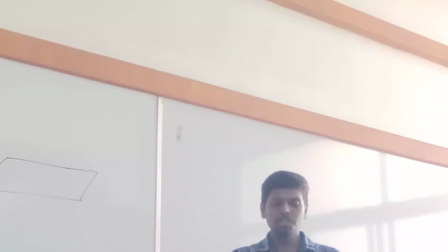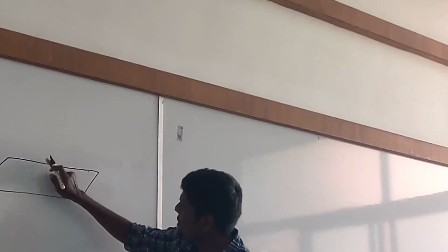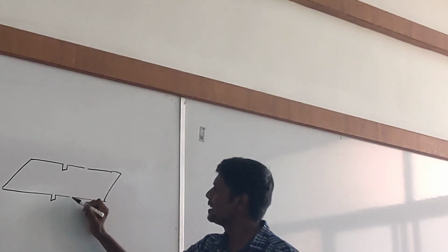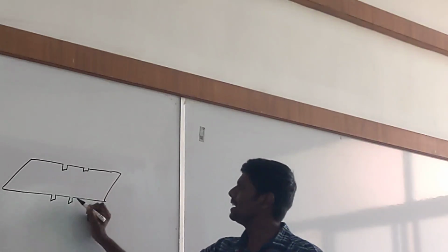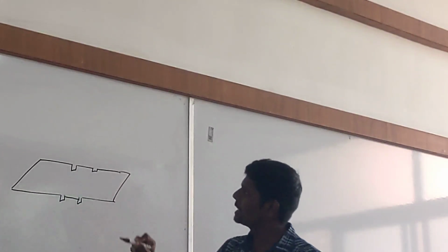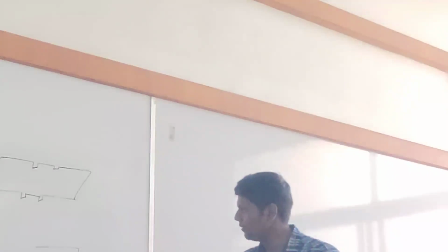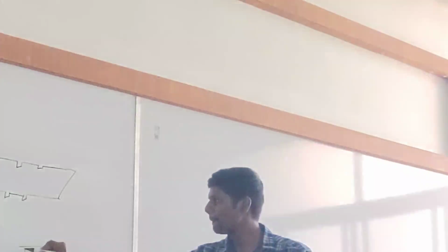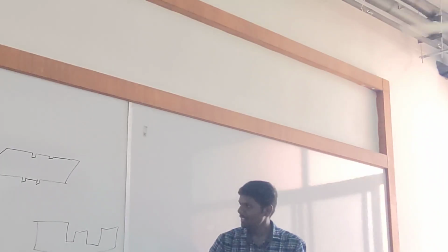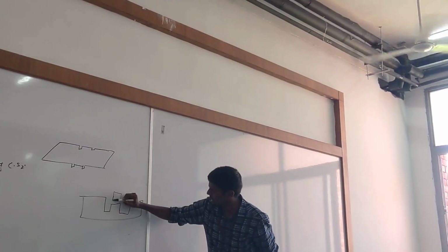Now, this Neubauer chamber has, listen, a depression. See, there is a depression like this. Then I will show one more diagram here, the side view. This is the side view, like this. Here you can see this will be the central trough. On this central trough you can see this grid.